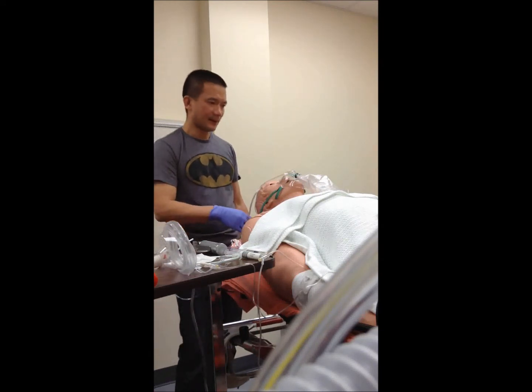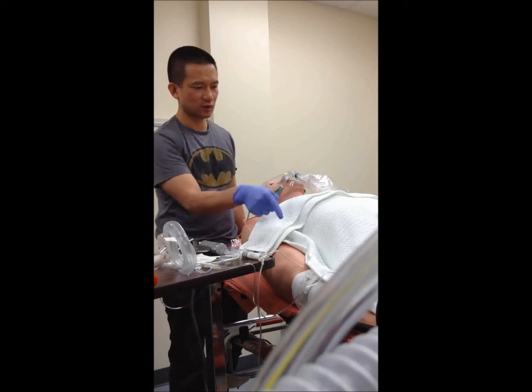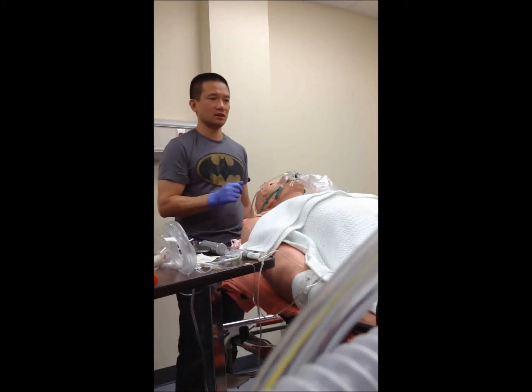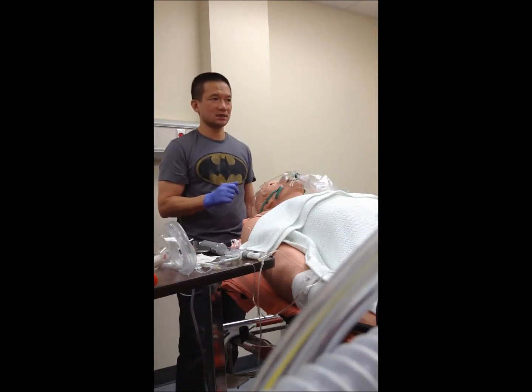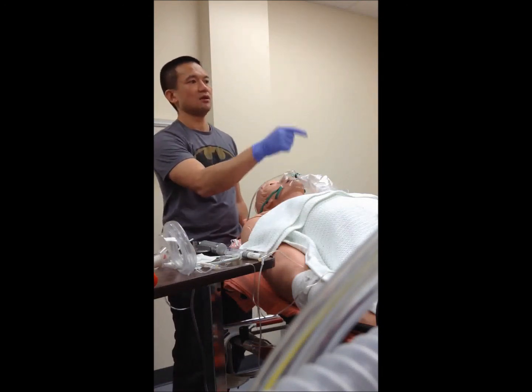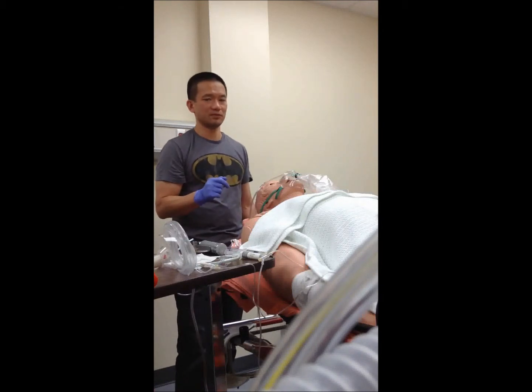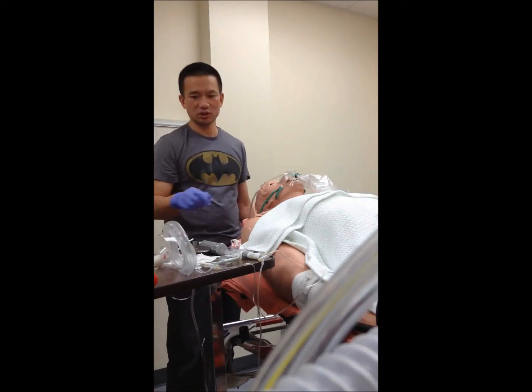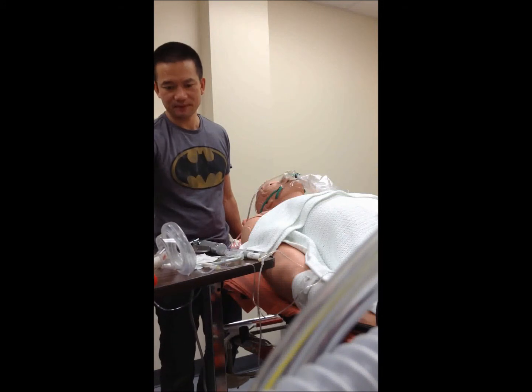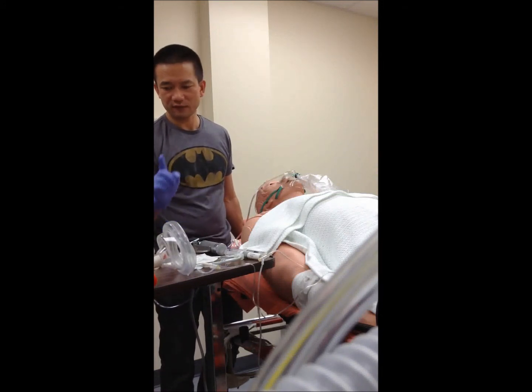I — IVs: we've got two IVs, you've checked them, they're running good. C — we've got a cardiac monitor going, we're cycling the blood pressure, we've got end-tidal CO2 as well. B for bougie — we've got a bougie check. We've got our BVM check.